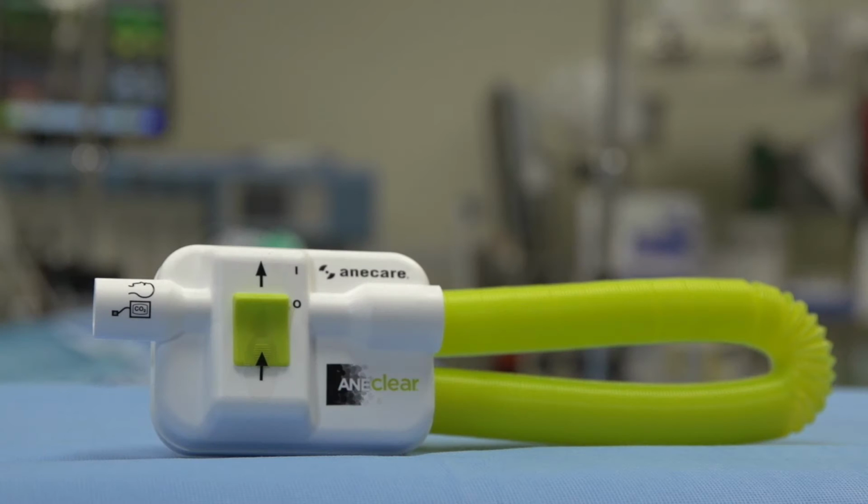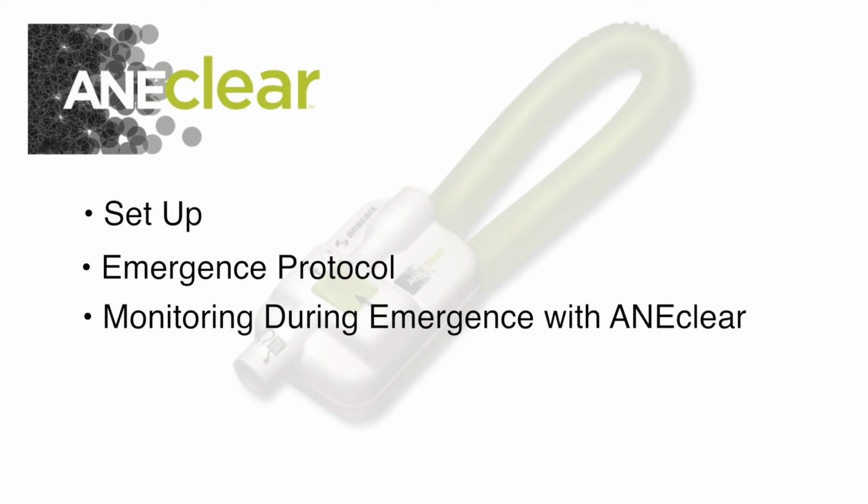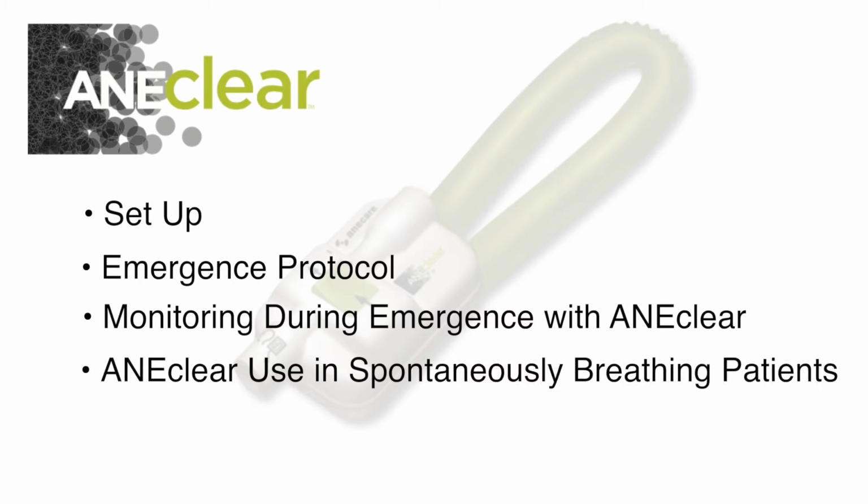This presentation will provide you with the most essential information regarding ANEclear and is formatted in chapters so you can easily navigate through the information. For more information, please refer to instructions for use or contact your ANEclear representative. Thank you for your interest in ANEclear. We hope this presentation will prove helpful to you. This presentation is broken into 5 sections: ANEclear setup, emergence protocol, monitoring with ANEclear, ANEclear use in spontaneous breathing patients, and ANEclear problem solving.